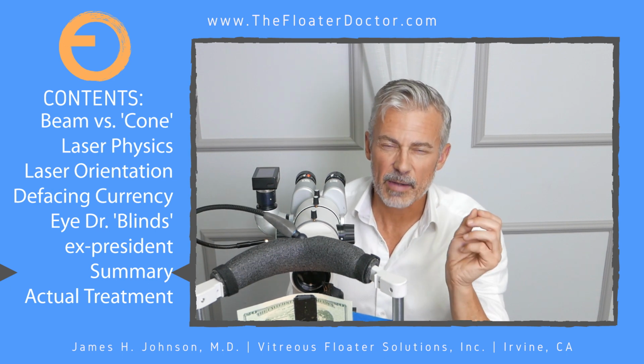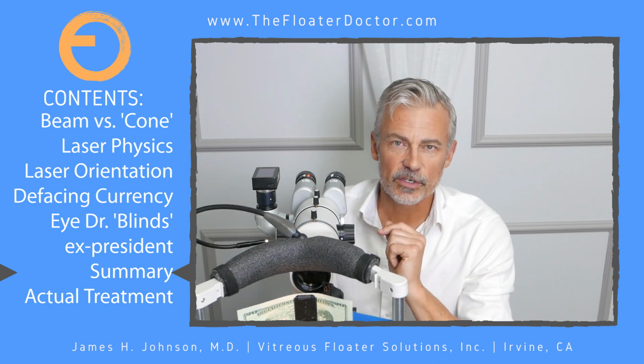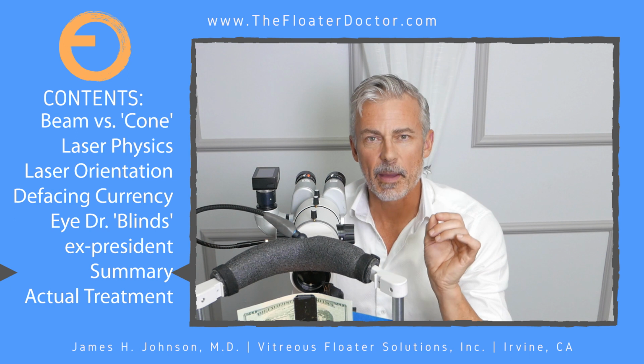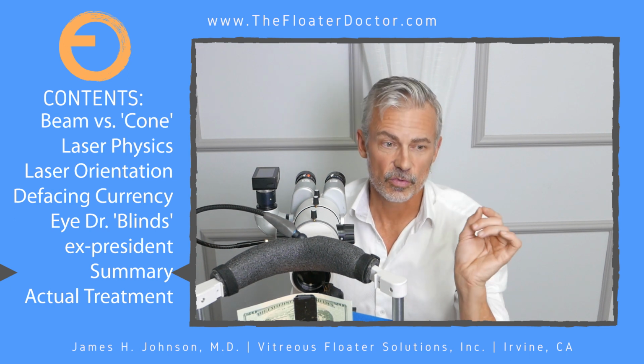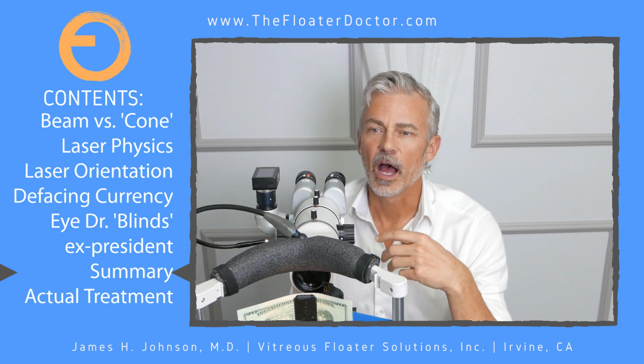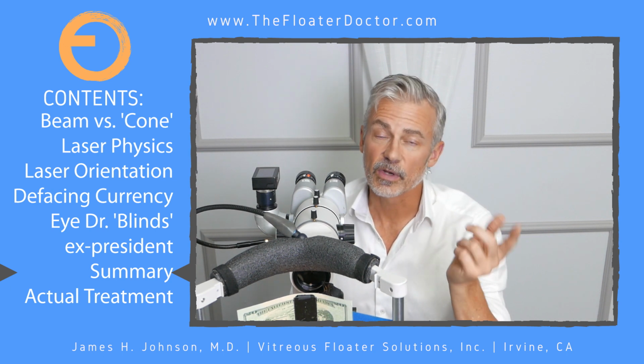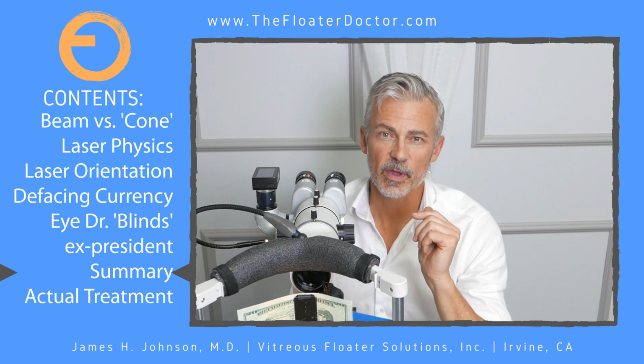So when I say I'm the bad boy of ophthalmology, it's not because I'm defacing US currency, it's because I'm doing something that many doctors have said to these patients: nothing can be done, you're just going to have to learn to live with it, it'll move out of the way, your brain will get used to it. That's just simply not true. At least it's not true for the patients that seek my help.